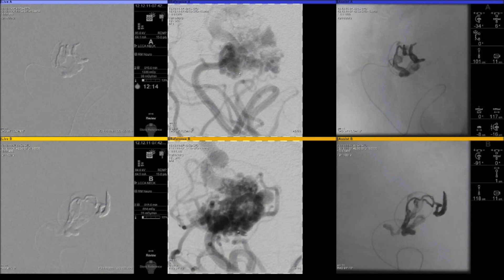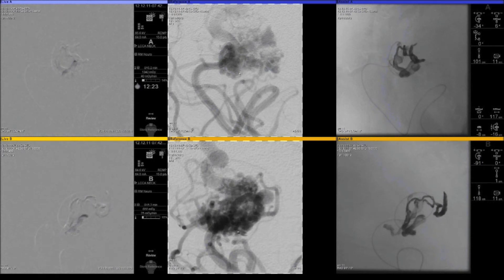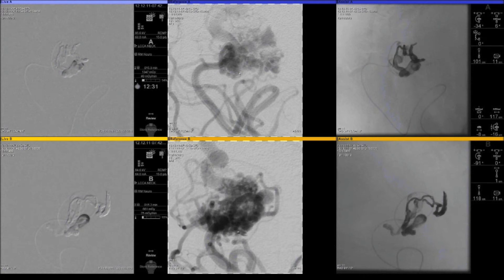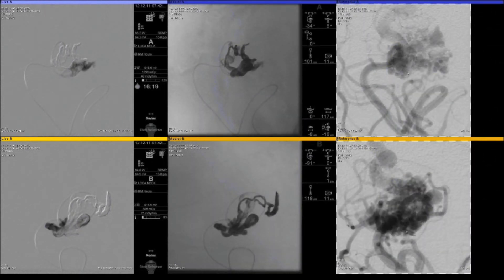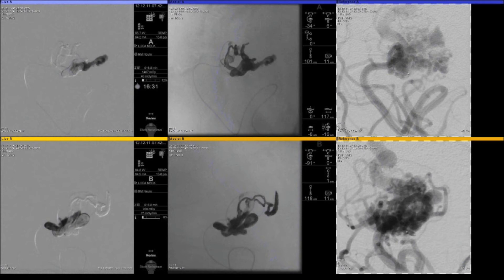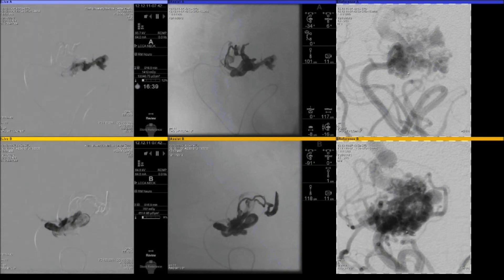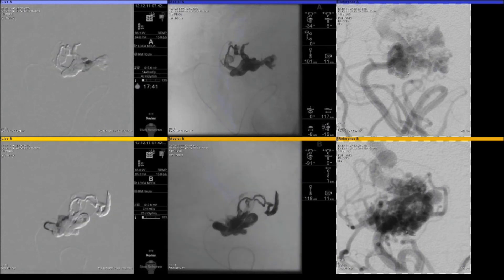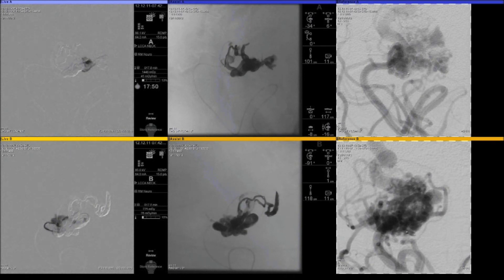Patience is key, and the use of blank roadmaps is very important as we gradually build. On the middle of the screen you see the appearance of the nidus. What we're doing with the Onyx cast is creating — reproducing — the image seen in the middle of the screen by gently tailoring the embolization to fill the shape of the initial nidus. The key is knowing when to stop, with continuous observation in AP and lateral planes. I choose a mid-nidus view so that you don't see too much artery or too much vein.